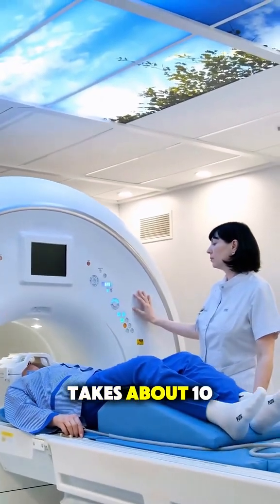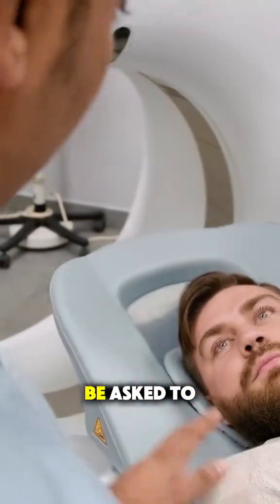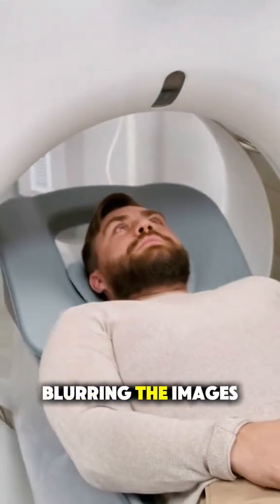The scan usually takes about 10 to 30 minutes, and you may be asked to hold your breath for a few seconds to avoid blurring the images.